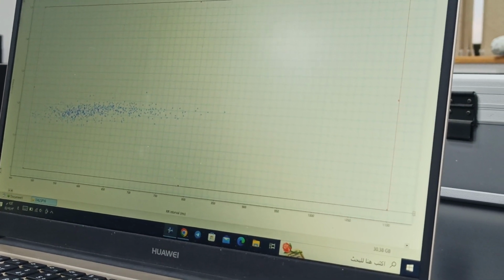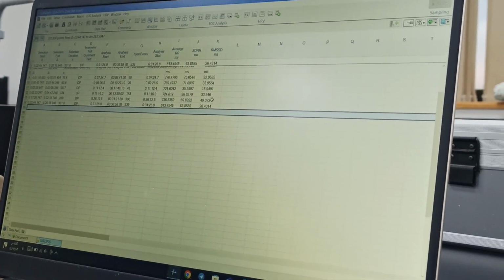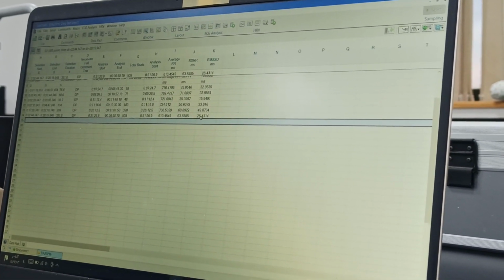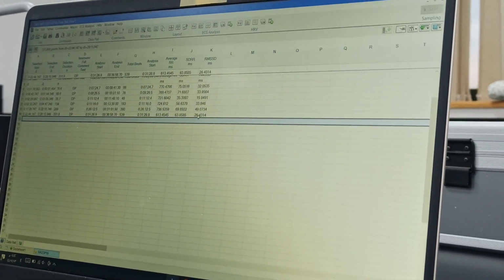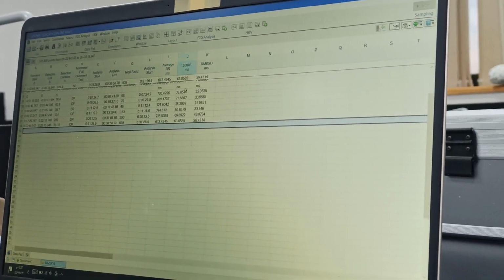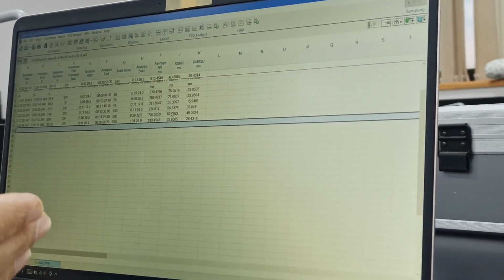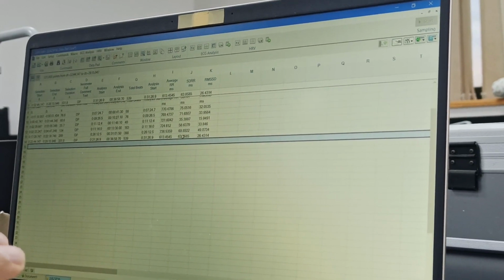Right. So now add to data pad and now see the differences, 1 or 2 differences, whatever it is. See, the RMSSD during tilt was 26, before tilt was 49. So there is a very clear shift that during baseline your parasympathetic is more active and during tilt it is less active. The same is true for this SDRR, but it is not very apparent here. Nevertheless, there is some degree. Here it is 69 and during tilt it is 63. There is a difference.